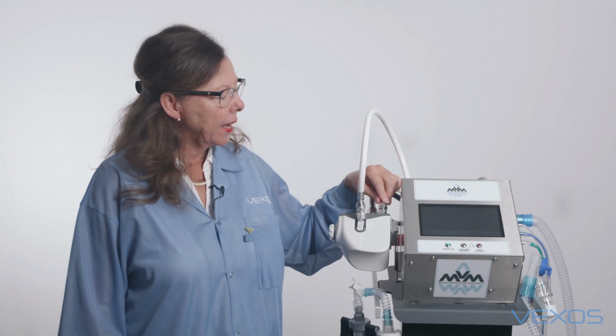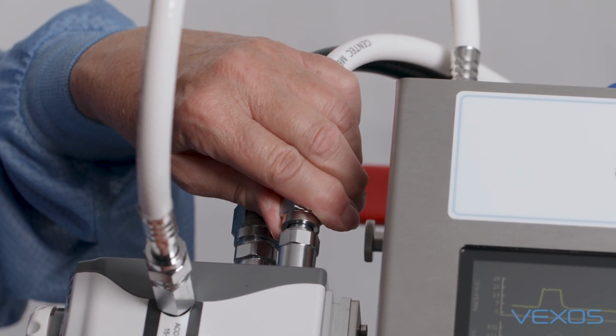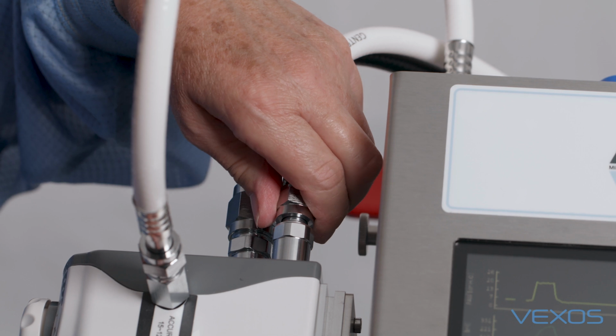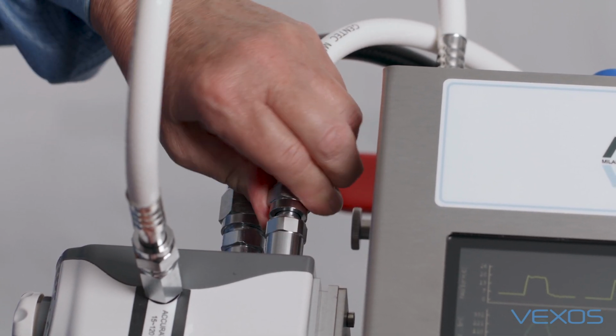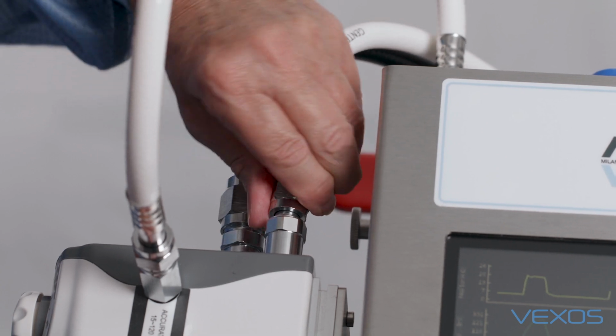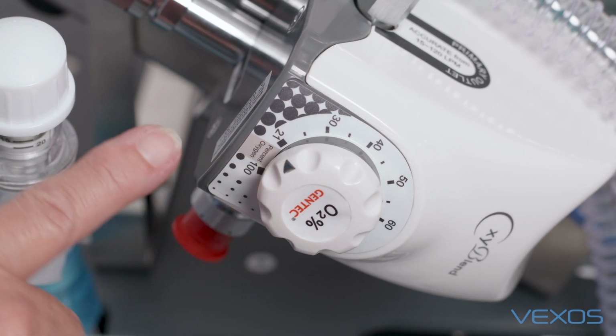This is the gas failure alarm, and simply disconnect the source. In this case, I've disconnected the air. Ensure that you're above 21%.